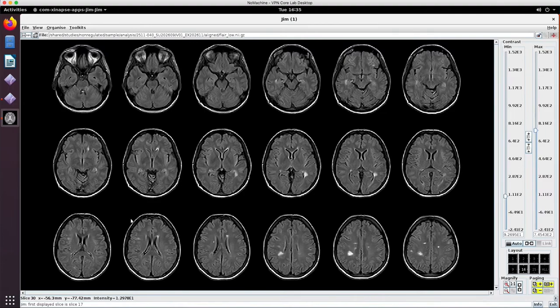Just as an aside, it may also be referred to as diffusely abnormal white matter. Yeah, very good point. So you'll hear it referred to as different things. And it'll be a bit of a challenge. And the way we deal with that is to also use semi-automated approaches and to try to rely for the delineation on some automated tools.